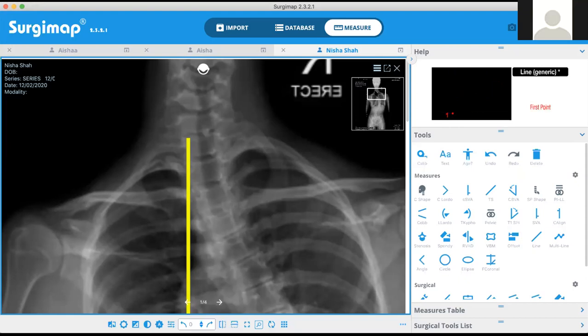Ashok sir, another thing that they mentioned is an intercrestal line. What Kshitij also said, perpendicular to the intercrestal line will be the one which they thought for before. No, that is what we have been using for so many years. Yes, that's been perpendicular to it. So either way, I got your point. You are saying parallel to the X-ray rather than the intercrestal line.